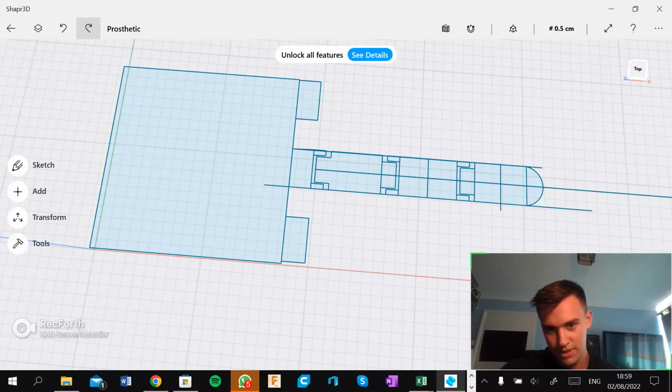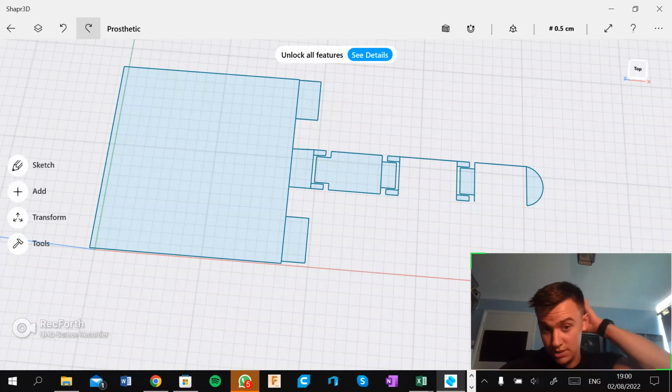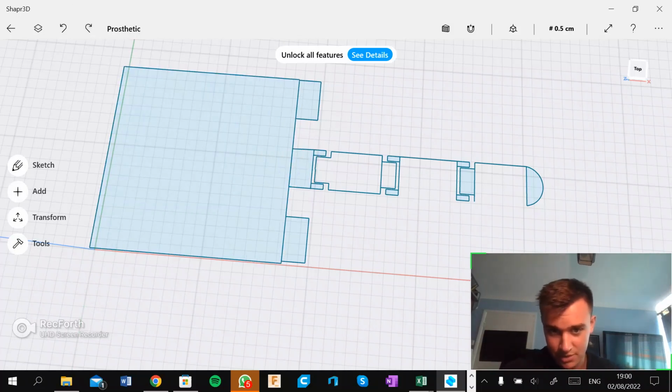And we just keep skipping through. We might see some things disappear, come back into place as I had to rectify things from the beginning. But that was what I settled on. There we go. It's me just tidying up, getting rid of my construction lines. I definitely enjoy these construction lines. I like things to be symmetrical and equal and work, even just little things like that. Soon that'll be rectified to make a solid sketch.